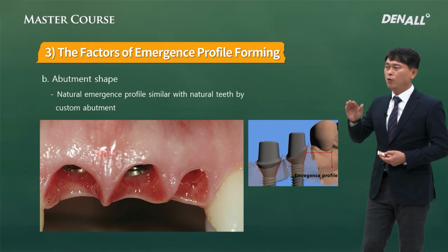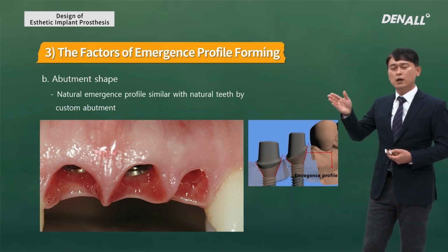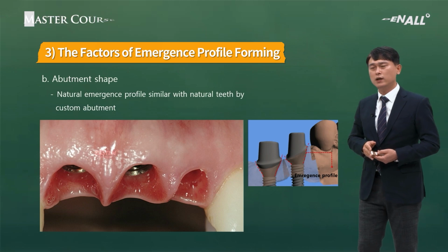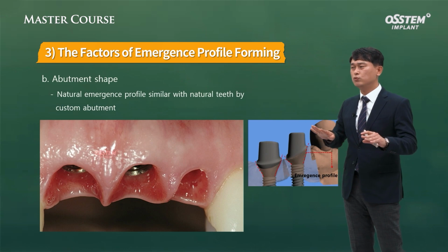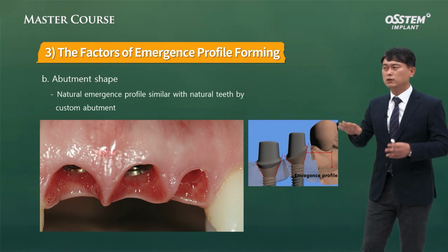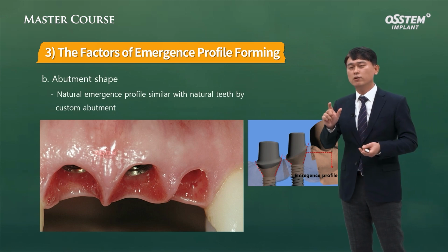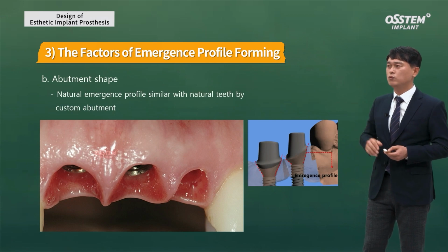If soft tissue is formed like this, it can work, but in the subgingiva area near the custom abutment, the soft tissue goes up in a straight manner. It should be in the shape of letter S. If the soft tissue is more curved, I believe the soft tissue thickness would be better, and it is called horizontal biologic width. So it would help a little bit if the thickness of the soft tissue is a little bit thicker with S shape.